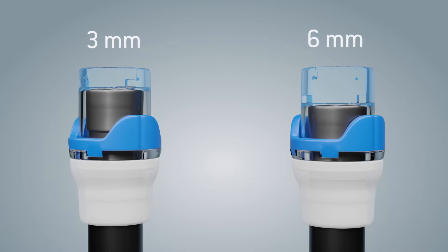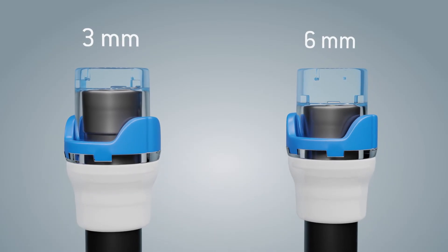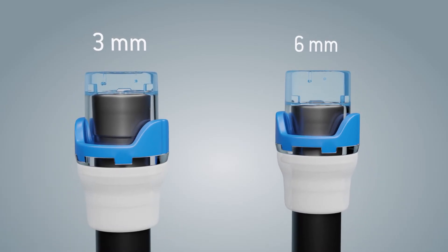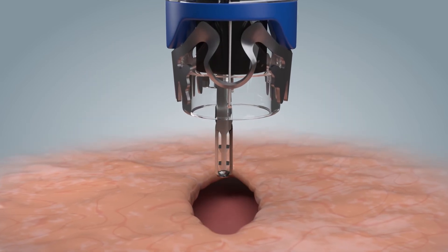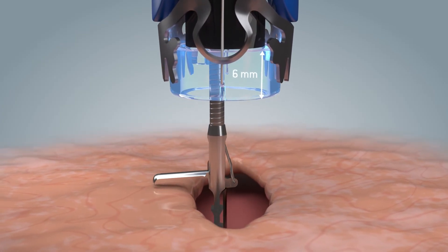The appropriate clip type and system size is selected by the user and depends on the requirements of the respective procedure. The twin grasper supports the controlled closure of lesions with its two jaw parts, and may only be used with a cap depth of six millimeters.